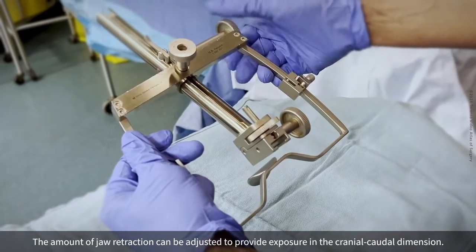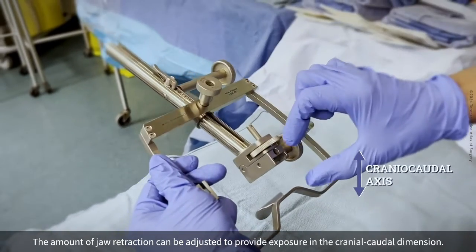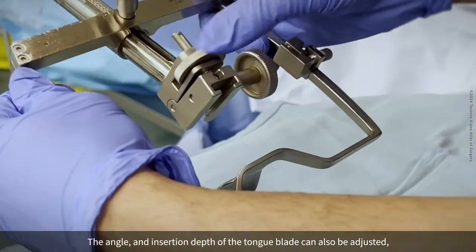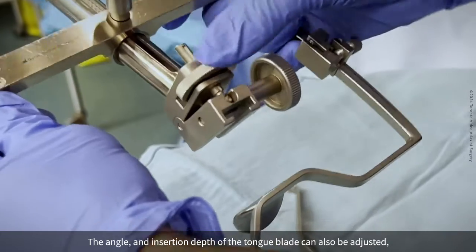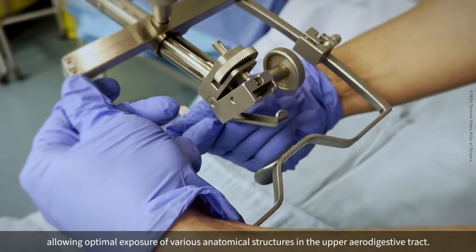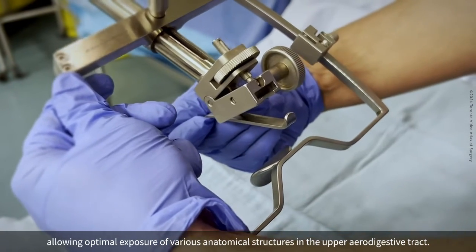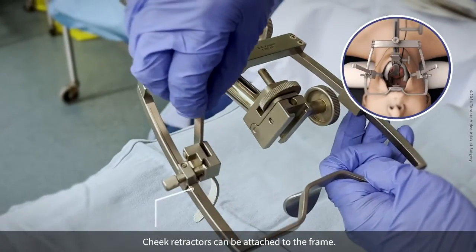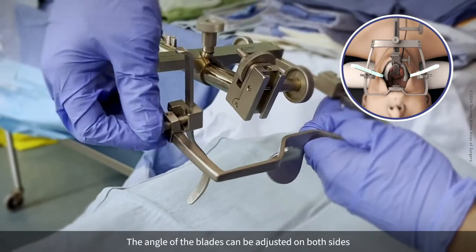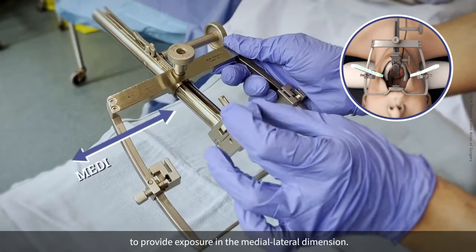The amount of jaw retraction can be adjusted to provide exposure in the cranial-caudal dimension. The angle and insertion depth of the tongue blade can also be adjusted, allowing optimal exposure of various anatomical structures in the upper aerodigestive tract. Cheek retractors can be attached to the frame, and their blade angles can be adjusted on both sides to provide exposure in the medial-lateral dimension.